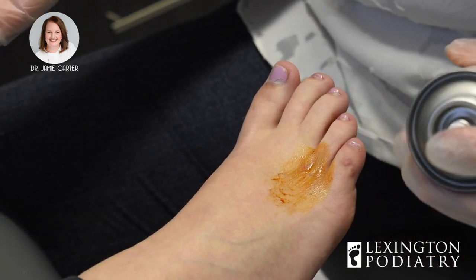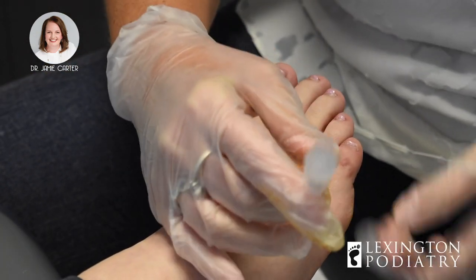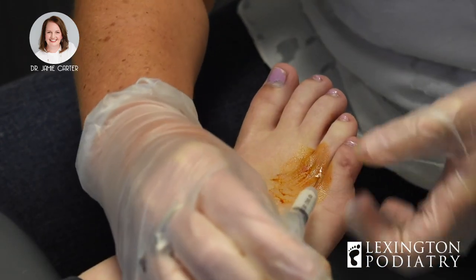All right, here we go. One, two, three. Sometimes you have to kind of pull on the toe to find the joint.